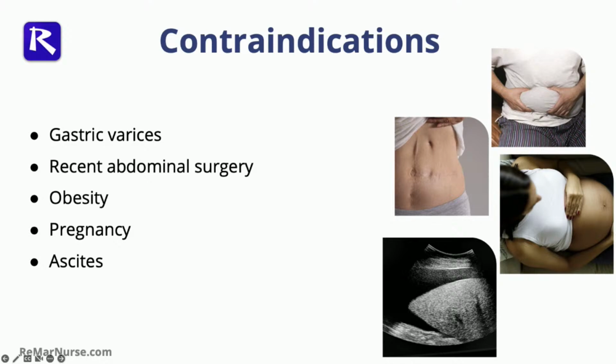If a patient has had a prior abdominal surgery, then we have to make sure that the tube is not passing through a part of the bowel that is weak already, and that it is being placed in a safe condition for the patient. Yeah, good job. Varices, bleeding.